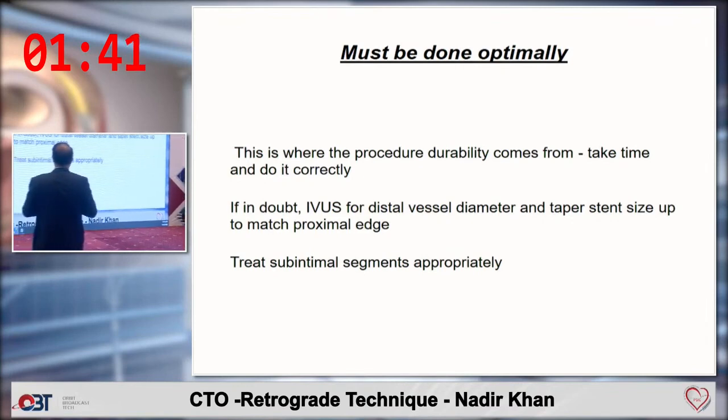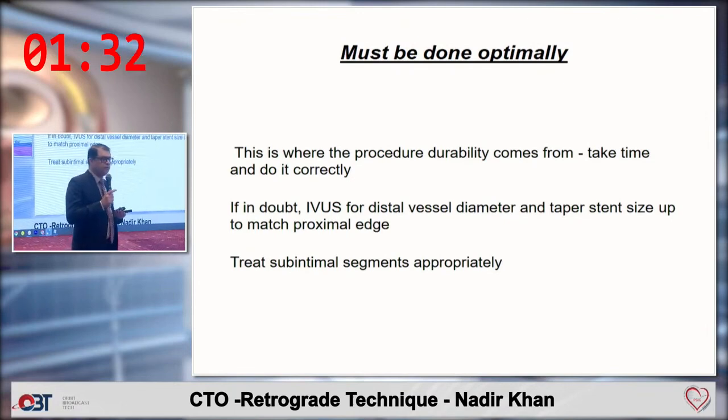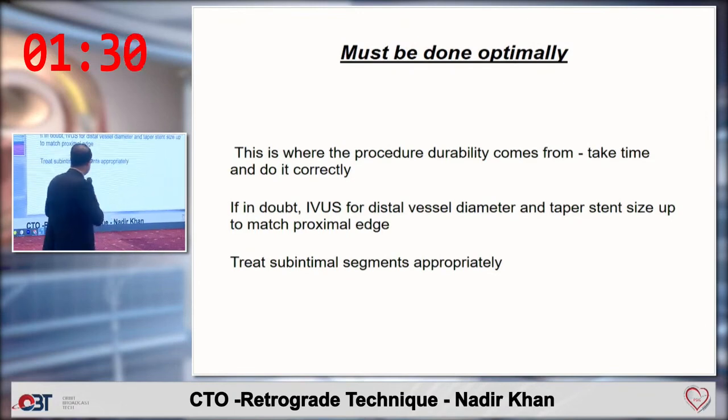So stenting must be done optimally, and IVUS, I think, should be done to optimize your stent size and your stent apposition with the vessel wall.